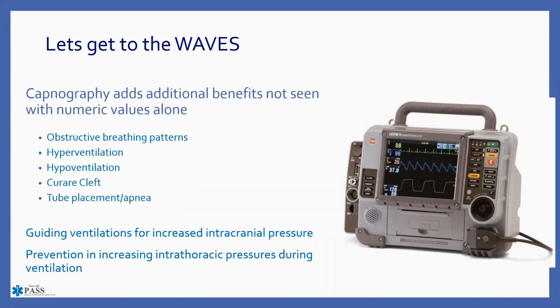And if you go back to when you were last taught CPR, the question is, how do you know if your ventilations are effective? The answer should be chest movement. When I see chest rise and fall, I know that I have ventilated that patient enough. Well, we already talked about tidal volume in a patient being around 500. Most of your BVMs are going to be about 800 cc's of tidal volume. So it is way overkill. If we can just simply ventilate the patient to where we see chest wall movement, then we don't worry about the increasing intrathoracic pressure because we're stacking all these breaths into their intrathoracic cavity.